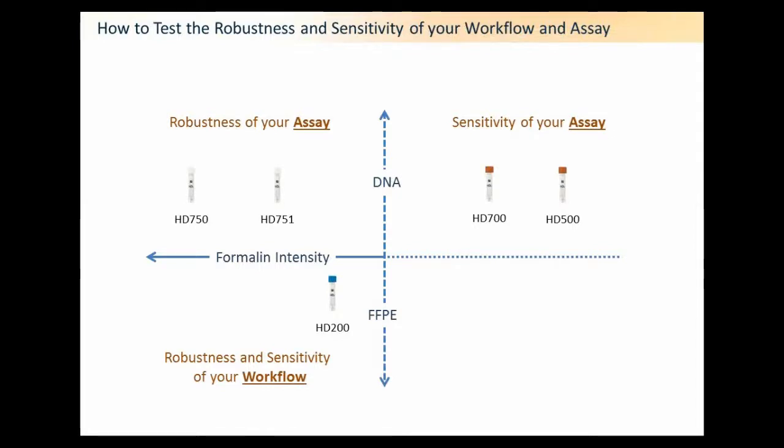We then have, if you wanted to ask the question, well, what's the robustness and the sensitivity of your complete workflow, we can then provide the FFPE sample, and then you extract the DNA from that and test for the specific mutations contained within the sample.